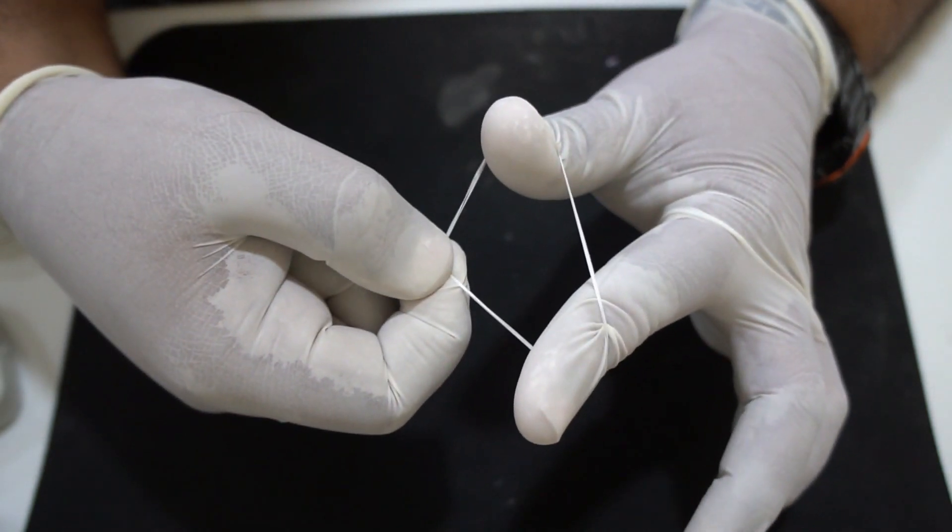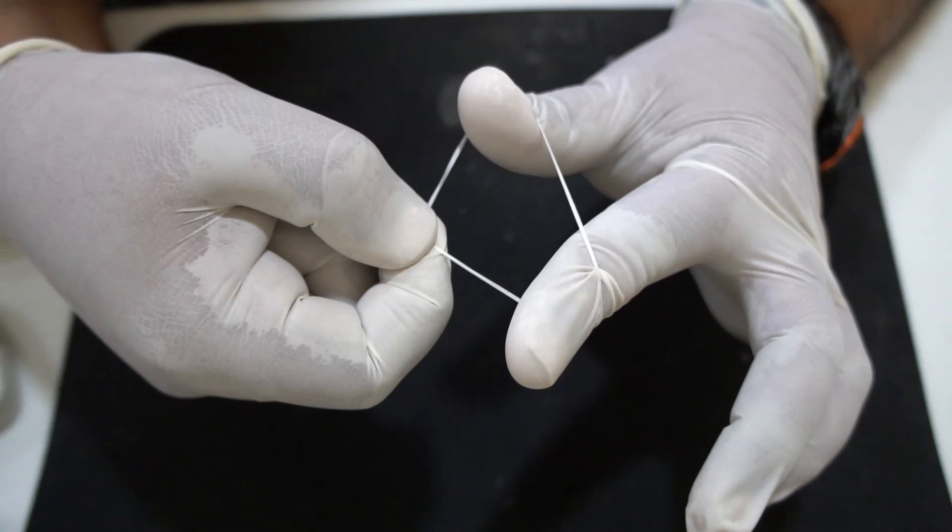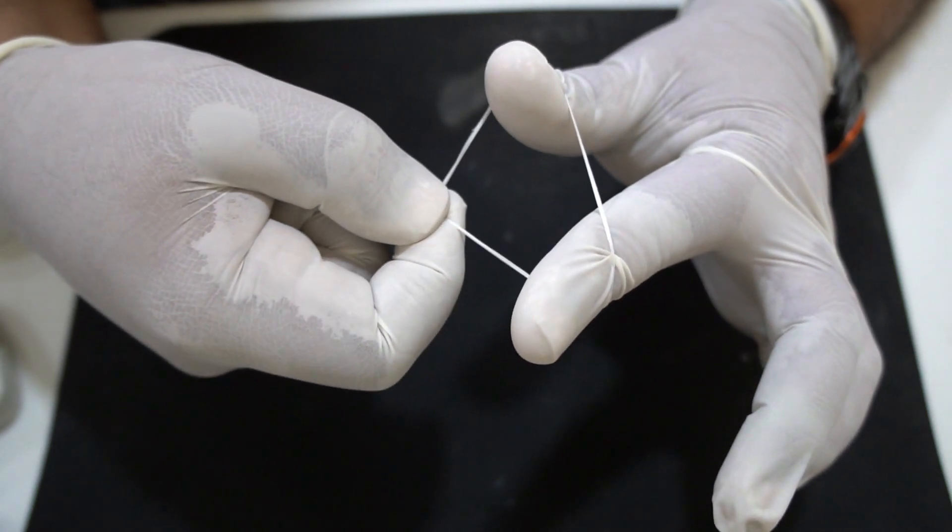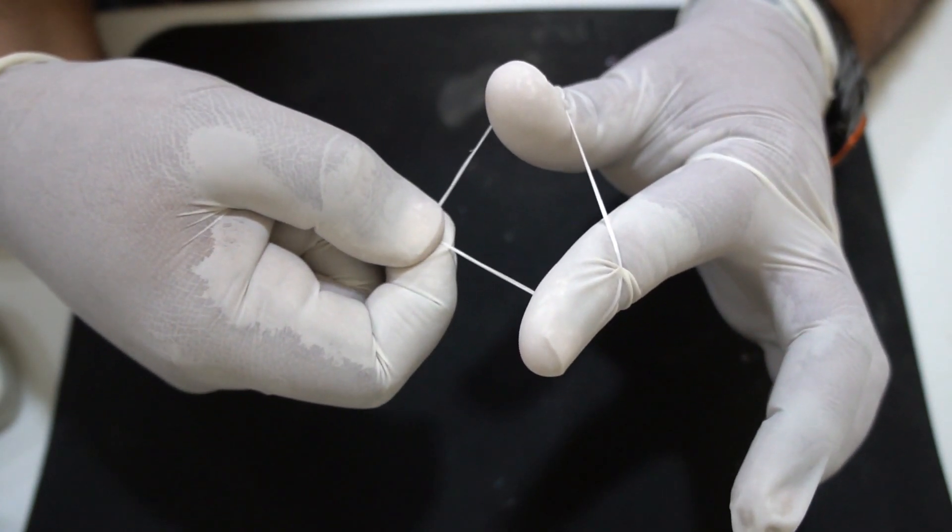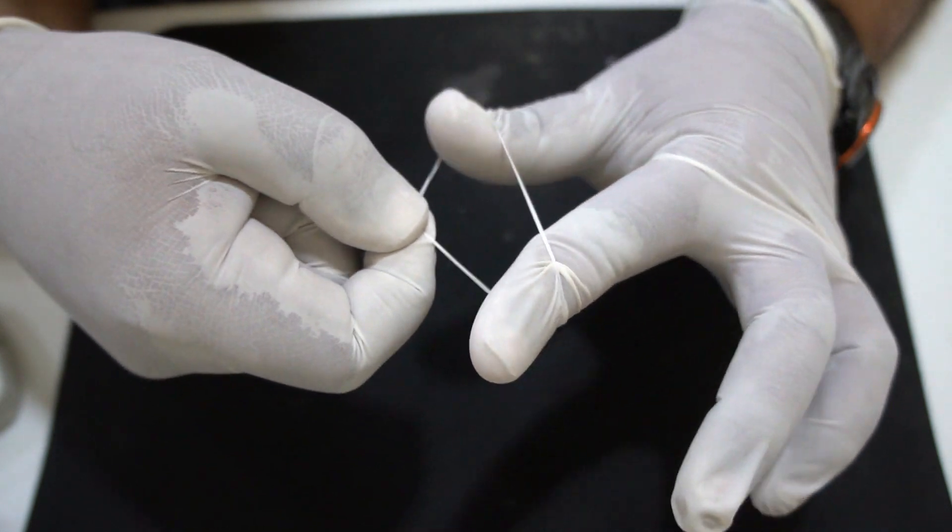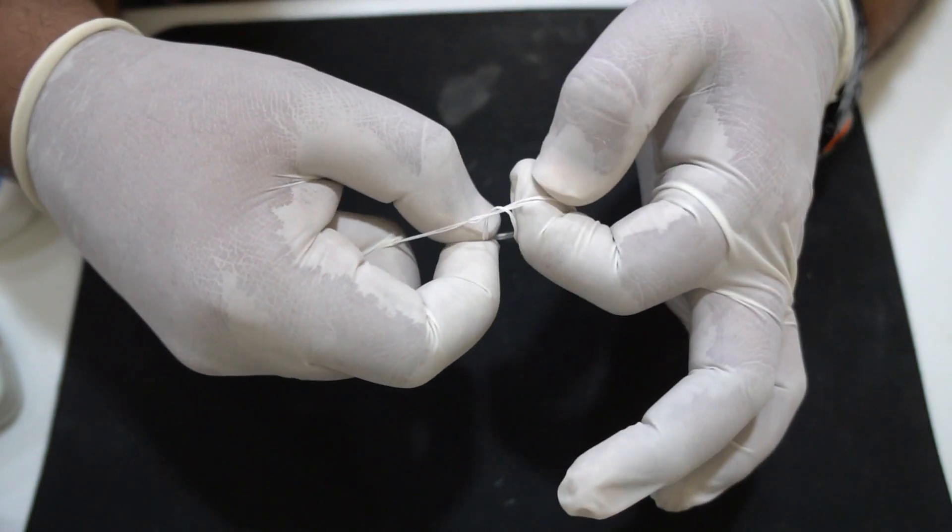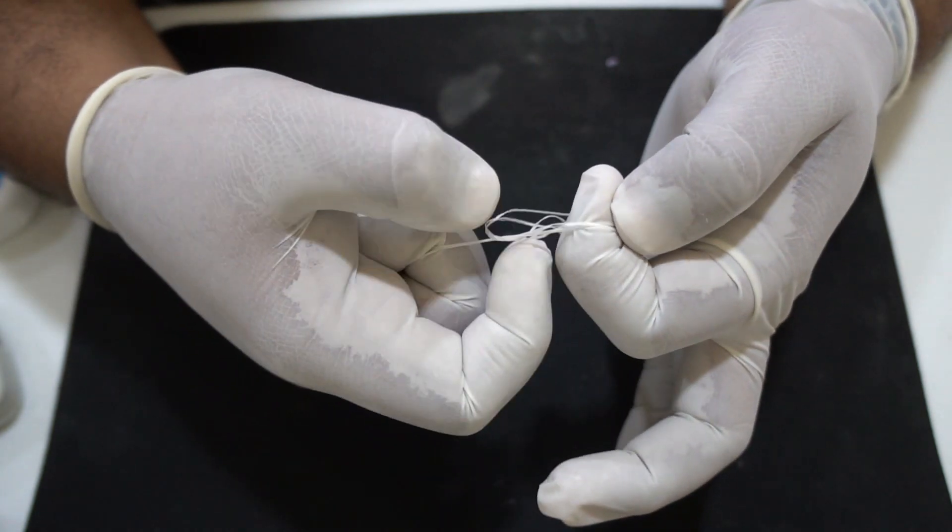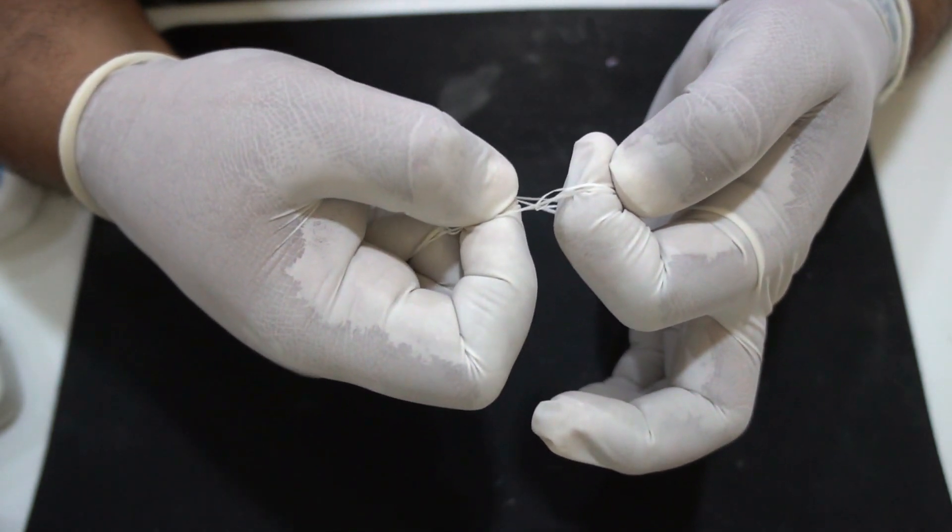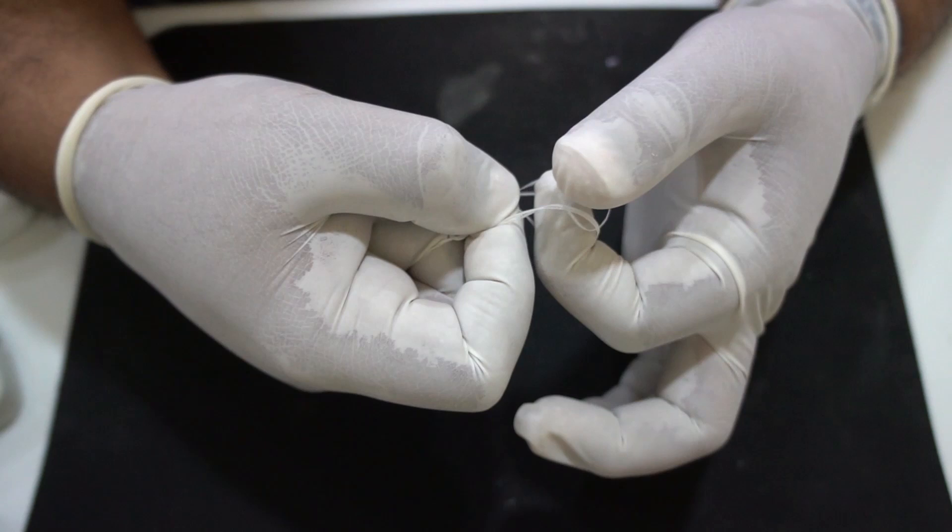Again stretch it between your index finger and your thumb. Move the floss again from the right side towards the left side. Again transfer it to the index finger.